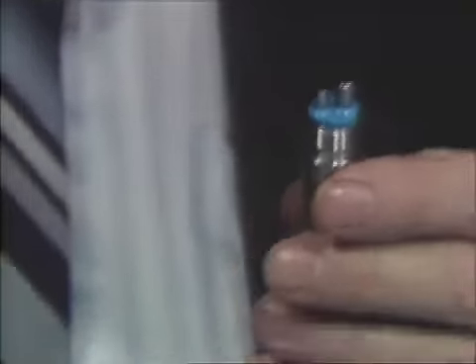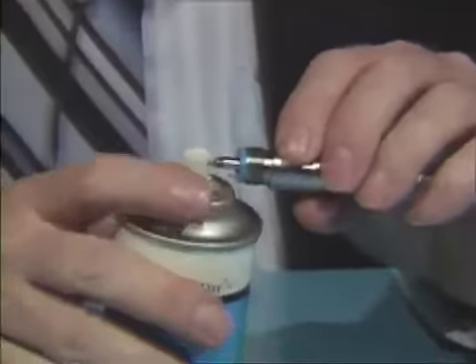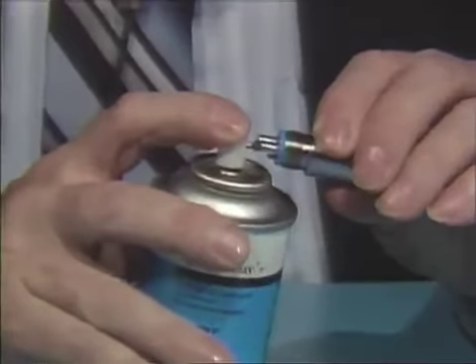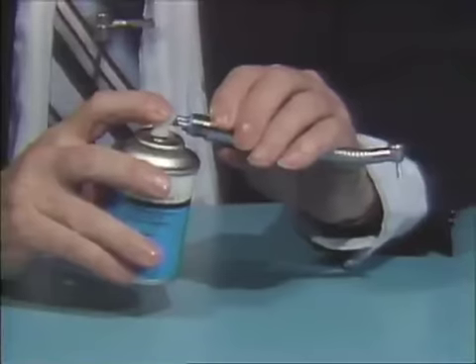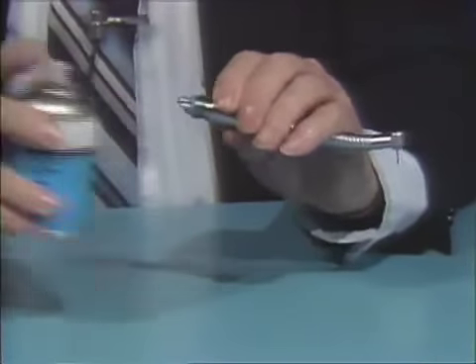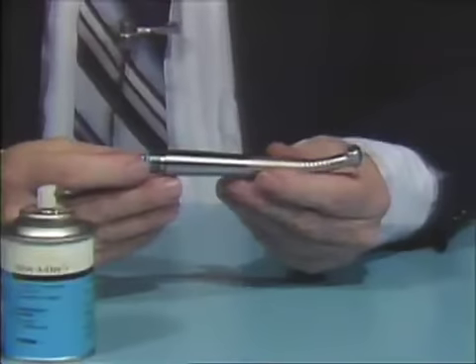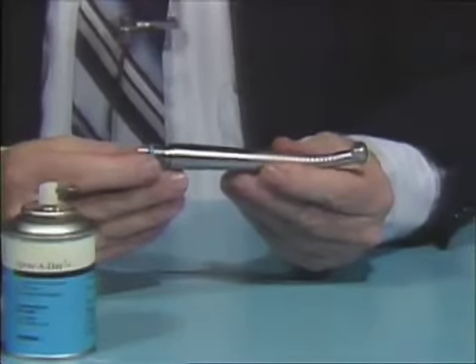Place the nozzle up against the drive-air tube fairly tight. Then give it one good squirt until you see lubrication coming out of the head portion where the burr is and the cap. Then run the handpiece just to get the excess lubrication out. It is then ready for use.